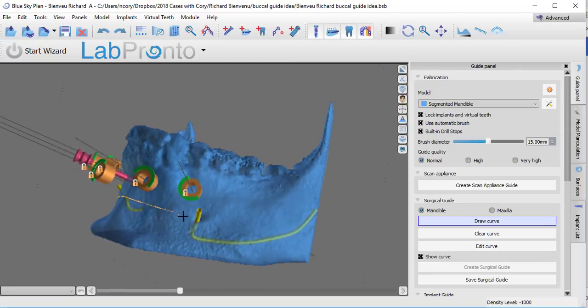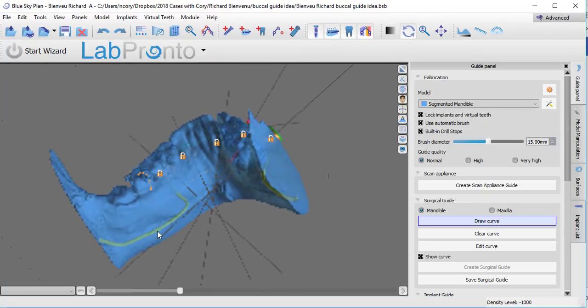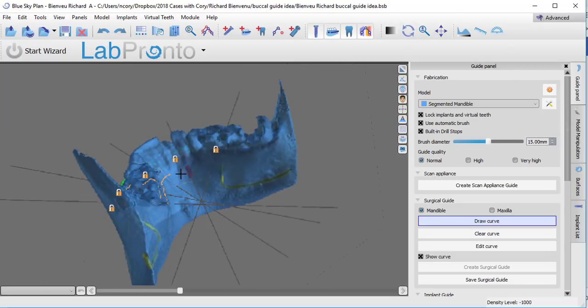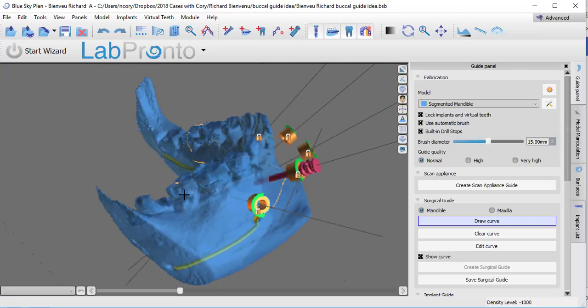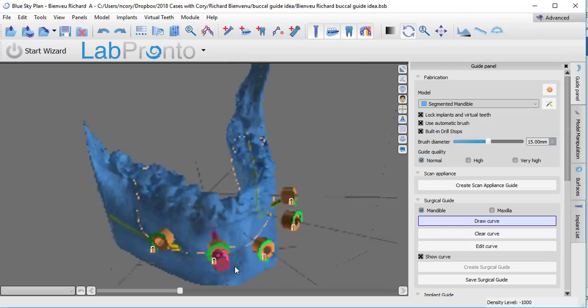I don't even worry about the nerve right now. I can just go right over the top of it. Let's go back to roughly the second molar. You don't have to go too terribly far on the lingual because all of that we're going to end up cutting away. But don't really worry about being over contoured with this shape right now, because it's very, very easy to go back and trim this thing down and to cut away excess. But if you don't have enough of it, that's a much more difficult process to overcome.